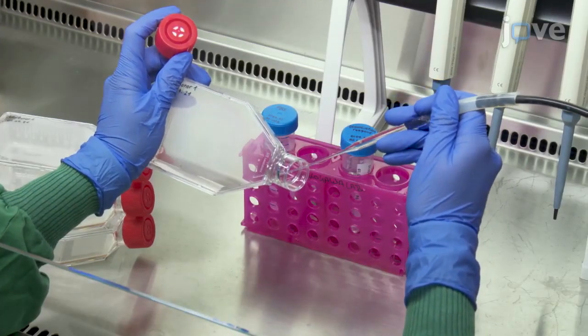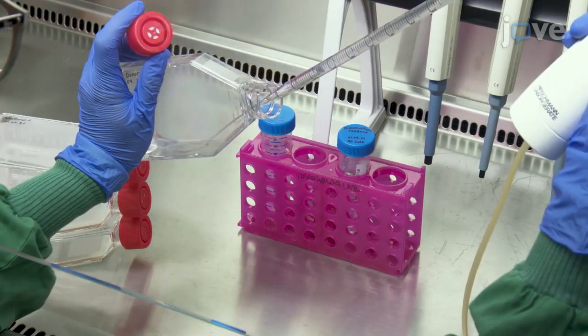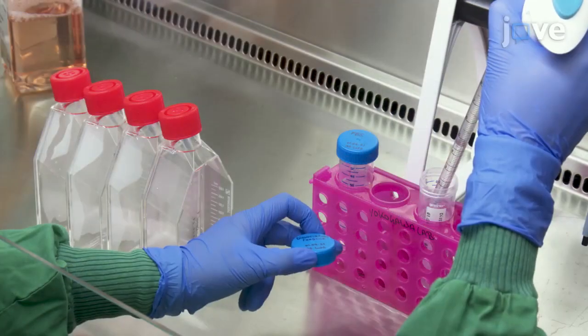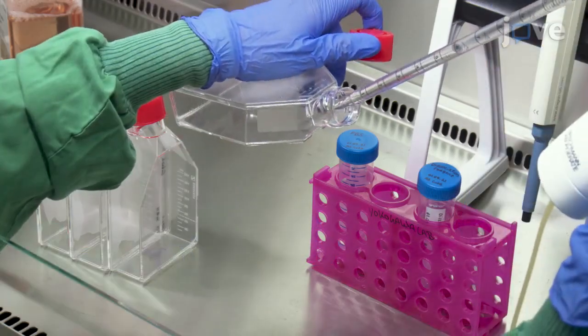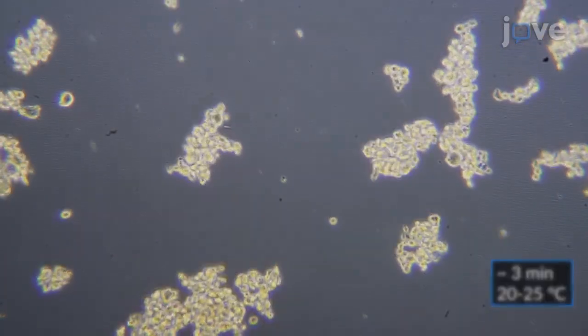After aspirating the medium from the cultured cells, wash cells with 6 milliliters of PBS and aspirate. Then add 6 milliliters of the cell dissociation reagent to the cells and incubate until the cell detachment is visible. Neutralize enzymatic activity.